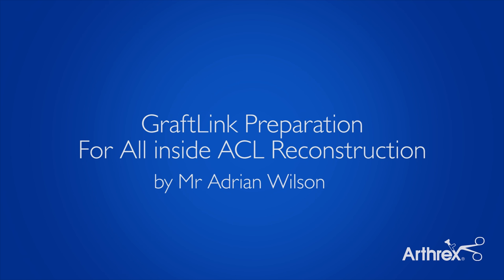We're going to be demonstrating graft preparation for all inside ACL reconstruction using a quadrupled semitendinosus tendon to make the graft link.